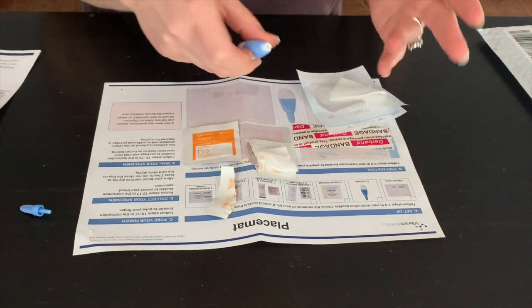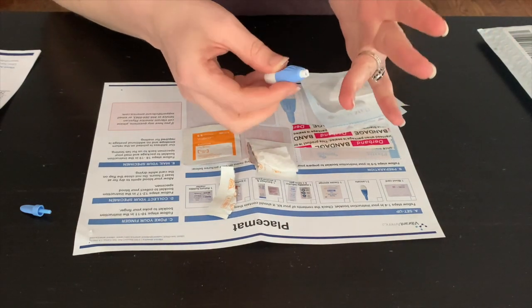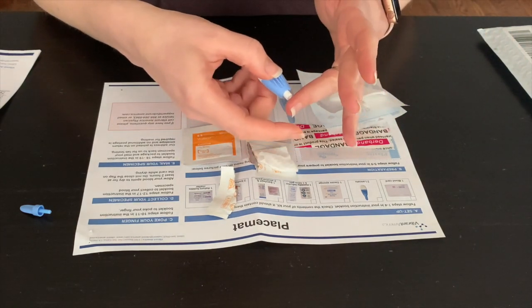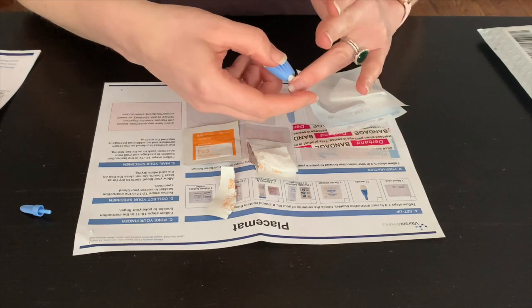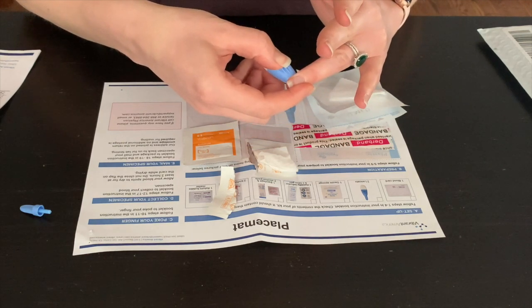With your palm facing up, press the lancet to your finger until you hear a click sound and feel a slight pinch. You should see a drop of blood begin to appear.